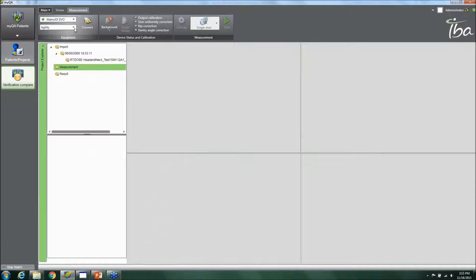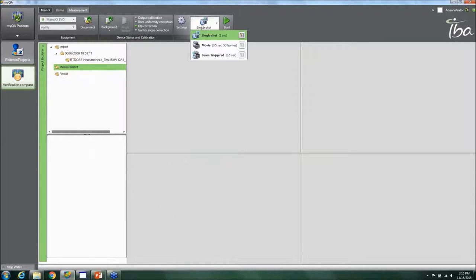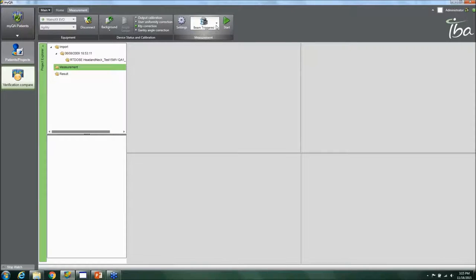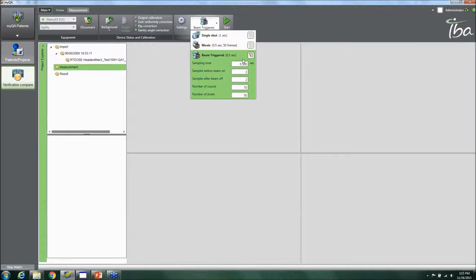Going to the Measurement tab, you click on your detector, connect to the detector, and then take a measurement. There are several different modes: single shot, movie mode, and beam triggered. The beam trigger mode is particularly useful — you can edit settings including sampling time, number of samples before measuring beam, number of counts, and number of pixels.